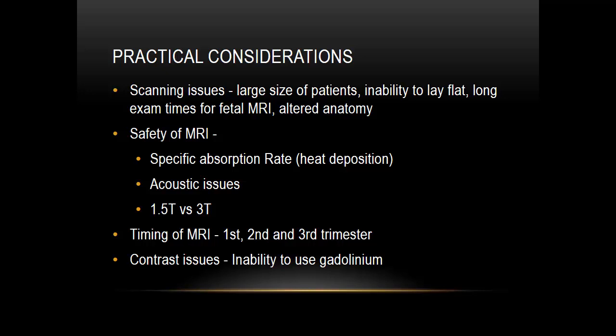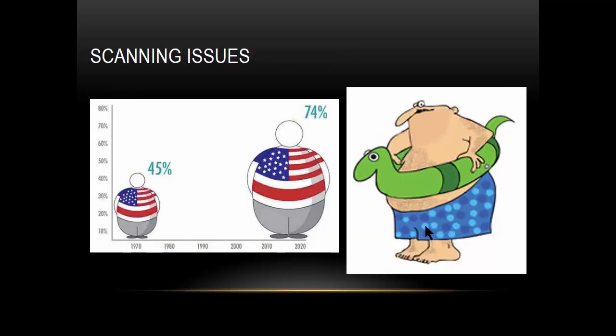There are a lot of scanning issues. You, of course, have to consider safety of the MRI in pregnancy, and then when should the MRI be done? And of course, we'll talk about contrast, if it is indicated or not.